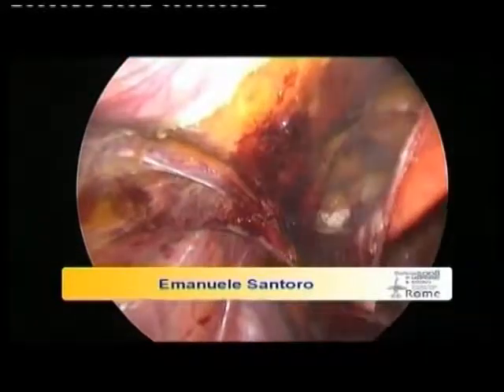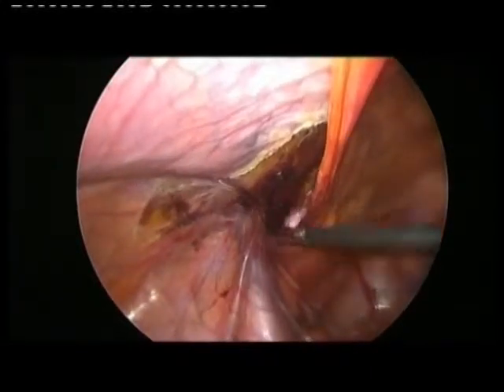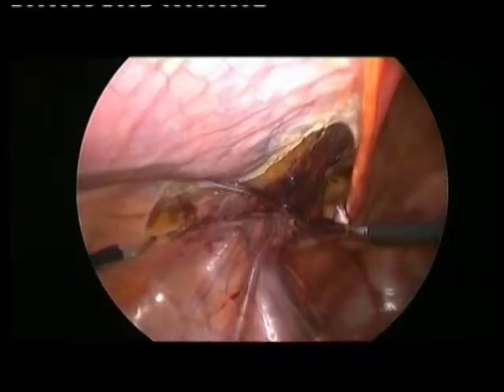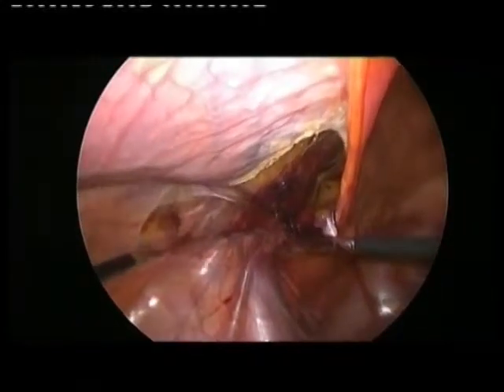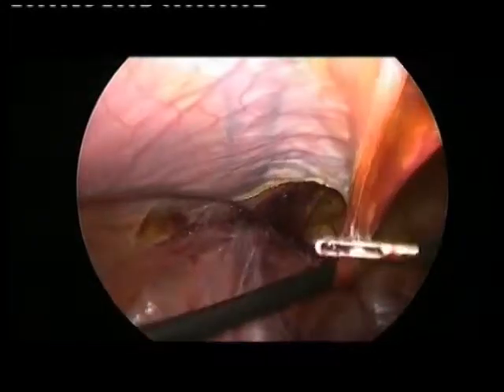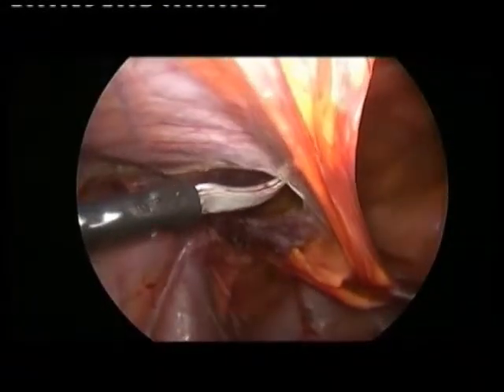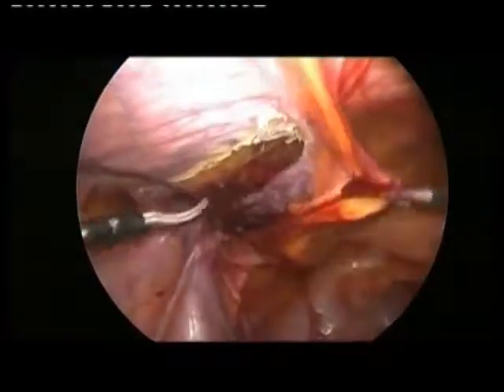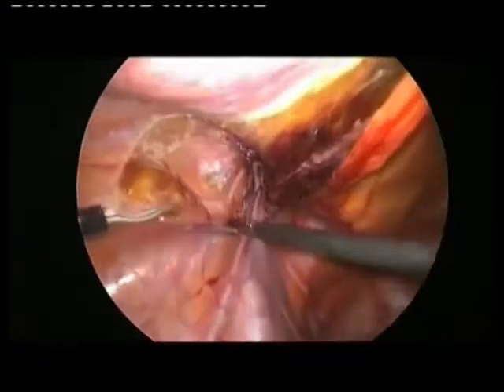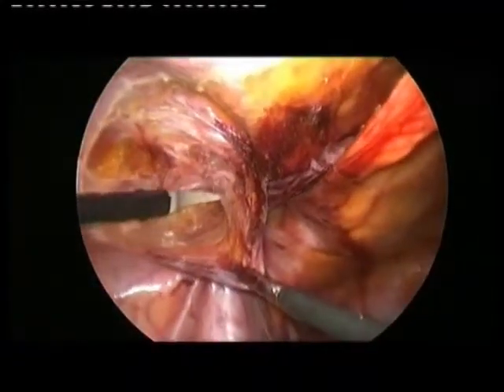Explain, I did the peritoneal incision. Okay, in the standard fashion, you see, I started a few centimeters above the inguinal ring, 2 centimeters laterally to the inguinal ring, and then I arrived to the lateral umbilical ligament. Okay, then I dissected a little bit of the lateral aspect. You see here, and a little bit of the medial aspect, the medial fossa, okay?